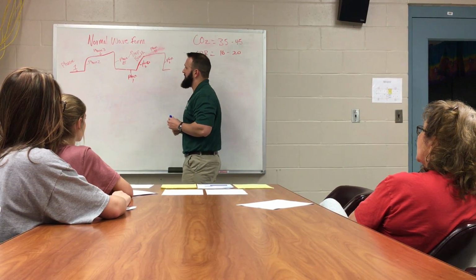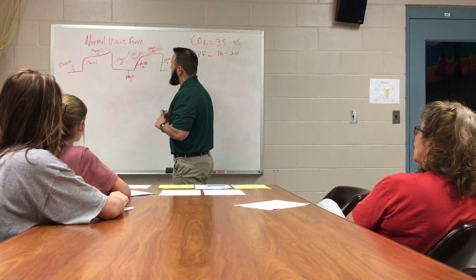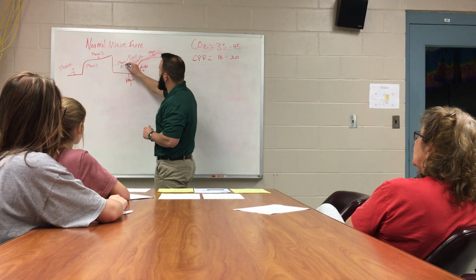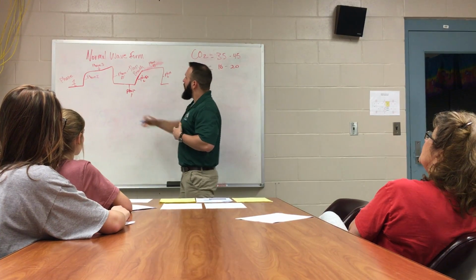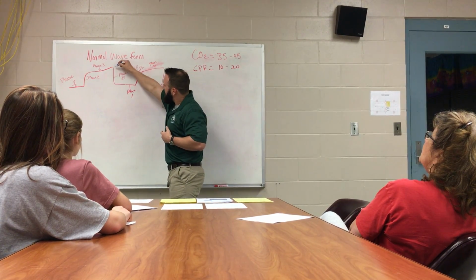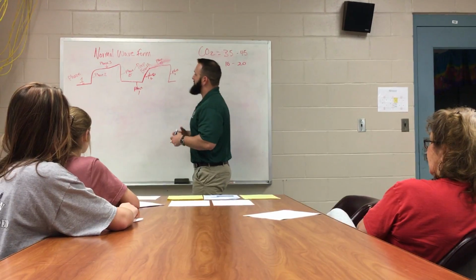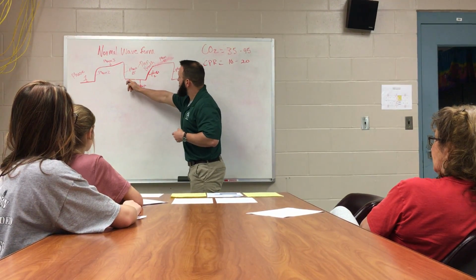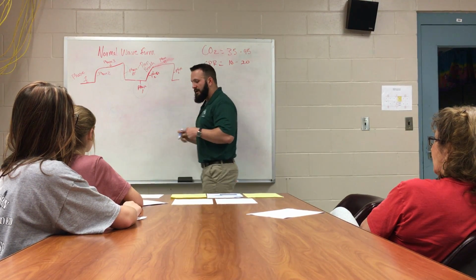So there's 3 different phases, well technically 4, of the waveform. So we're going to have this first phase. It's called phase 0. Phase 0 is our deep breath. Everybody take that deep breath again. Okay, we're all at phase 0 right here when we take a deep breath. As we start to get to the end of our deep breath, we sink right here at phase 1. Phase 1 is when we get to the bottom of that deep breath. So right there, I'm at my phase 1.